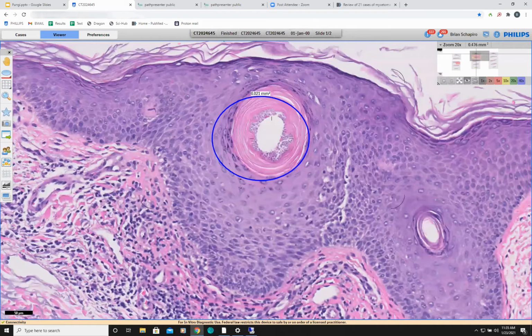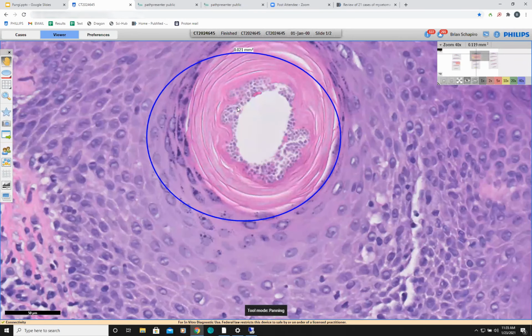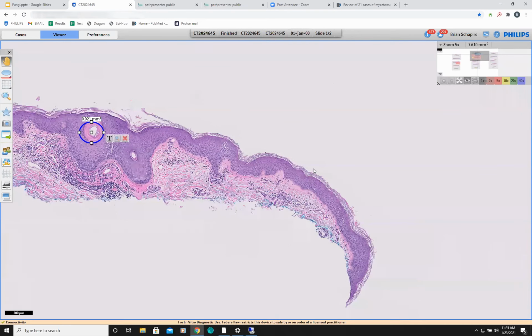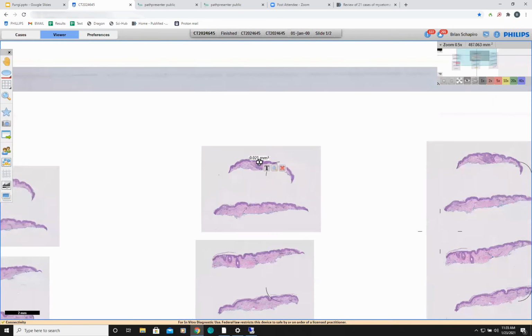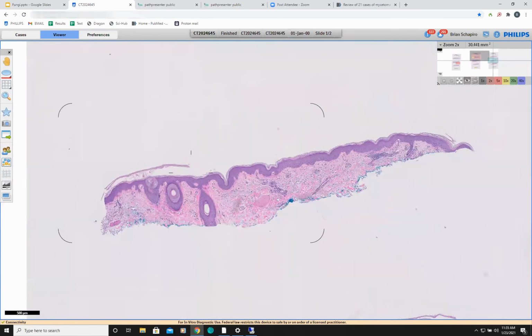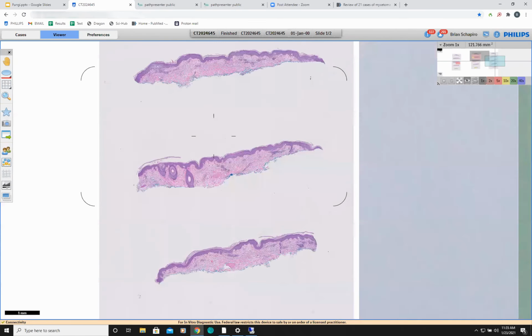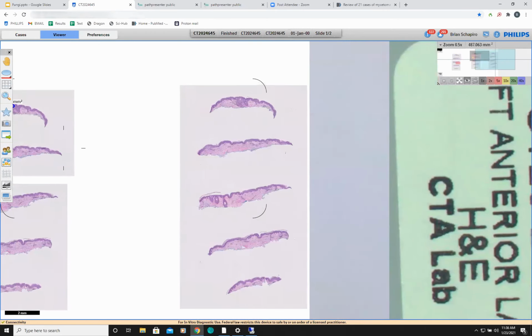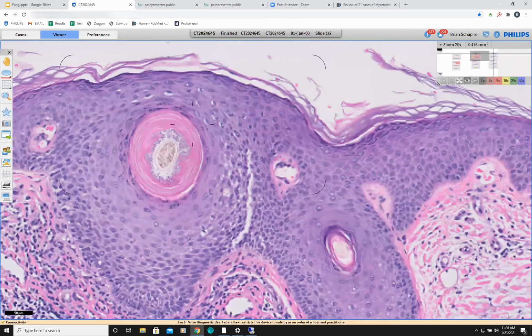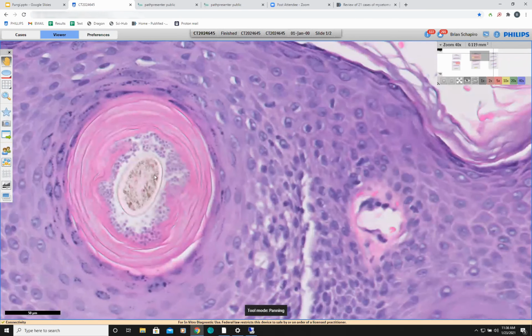And hiding out inside the hair follicle is endothrix. So the rest of the biopsy looks pretty normal. That's why in these biopsies that look fairly normal, PAS stain is always a good idea, and levels, because out of all these pieces, it's only on the one on the top here that you can see the fungal organisms.